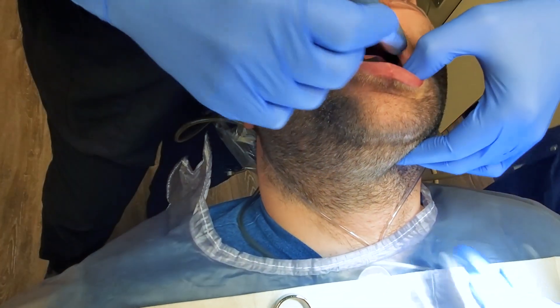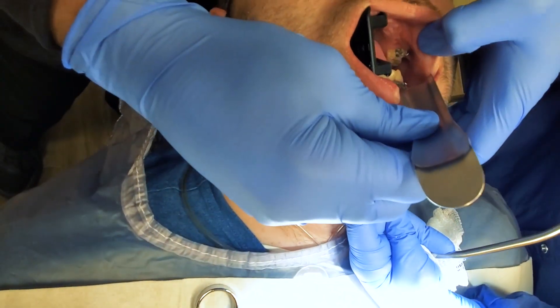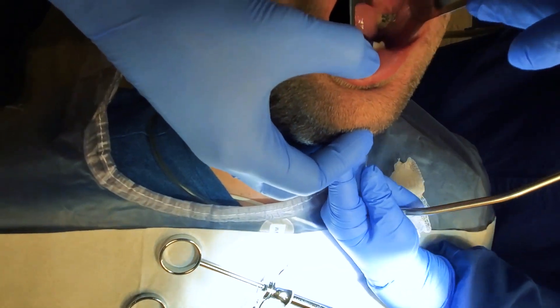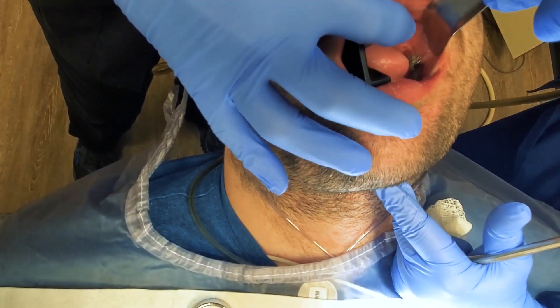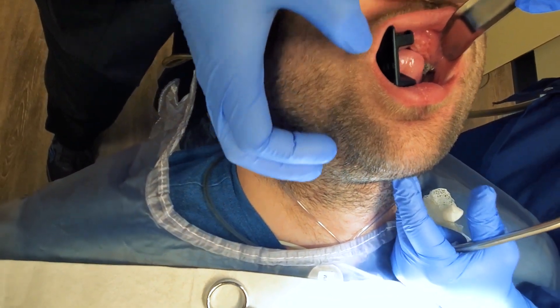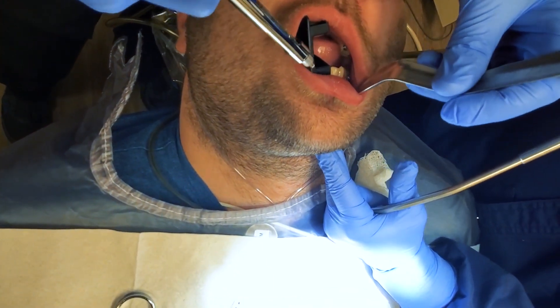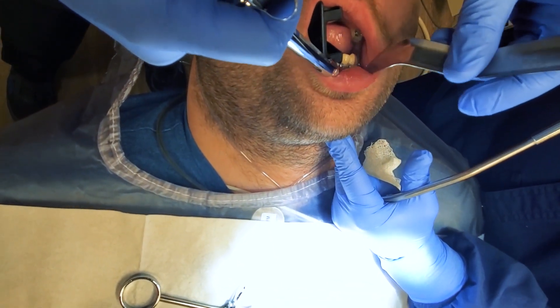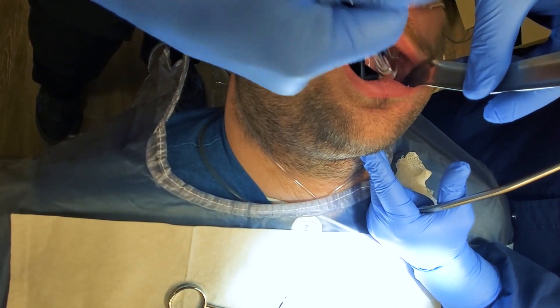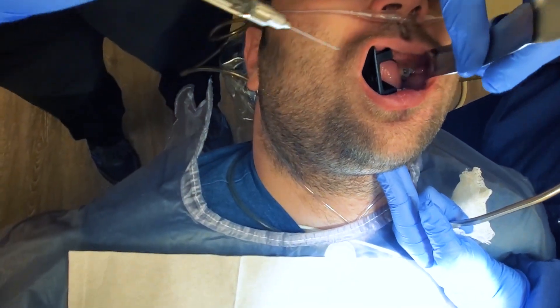This gentleman was in a moped accident and broke his jaw in three places. Right now we're going to take some arch bars off. You can see these arch bars and the wires holding them in place — the wires are called circumdental wires. He had all these teeth knocked out in the accident and then it's been bone grafted. I'm going to give him some local anesthetic. He's already sedated and very sleepy. Just a little local anesthetic in there, getting things super numb.